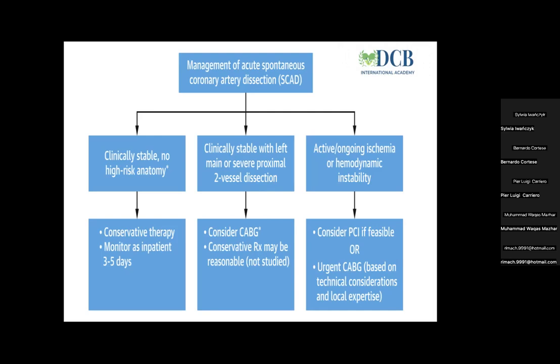One thing more I want to know. There are different schools of thought. If there is an emergency situation and you are going to put the stent, should we start the stenting from distal to proximal, or should we close the proximal entry point first, then go distal? What is your school of thought? My idea, even if we don't have data about this, is to start distally and go proximally, in order to reduce the risk of squeezing of the hematoma.